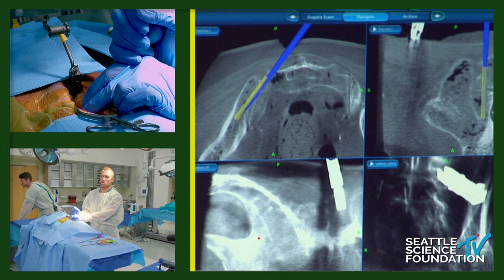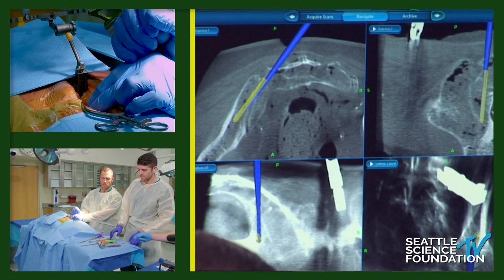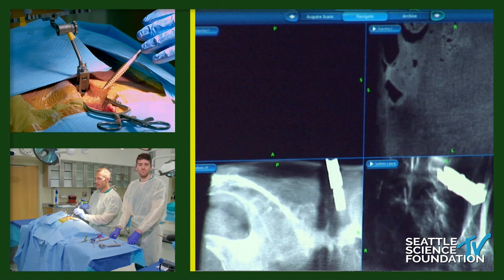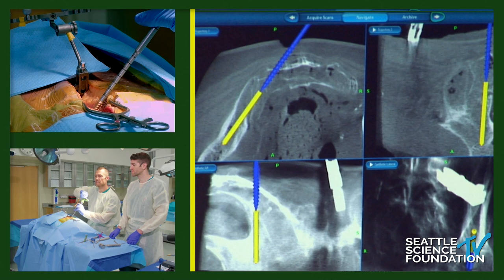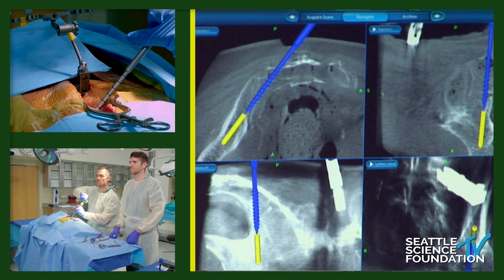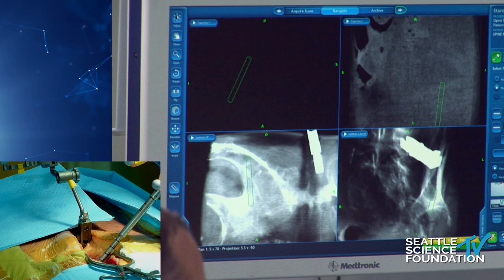Once I've established the track, I remove the gear shift. You could place a guide wire and proceed cannulated, but in this case I'm going straight to a tap. With this granite system there's a sequential tap system with both cannulated and non-cannulated taps available. I'm going to follow that same trajectory and let the tap advance itself. When using navigation, I apply as little forward pressure as possible and let the cutting flutes do all the work. Excess pressure risks fracturing the posterior sacrum and causing skive as you cross it.